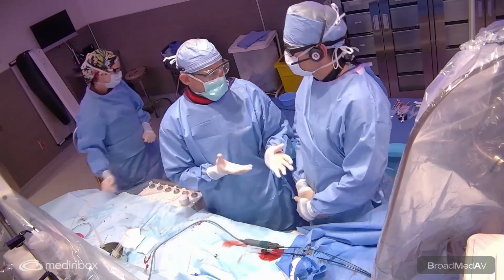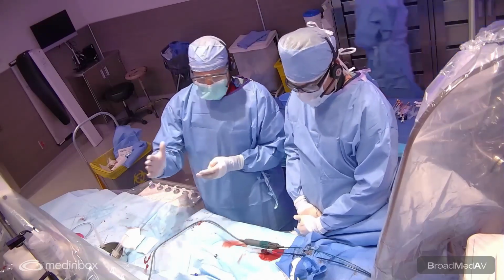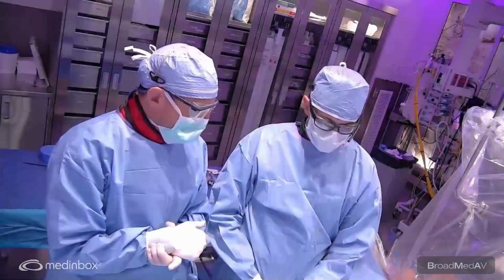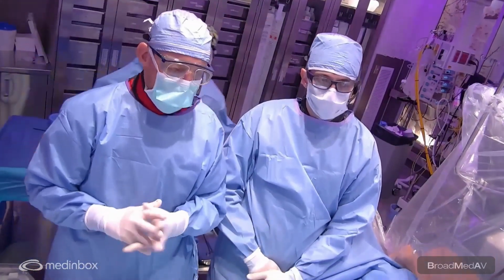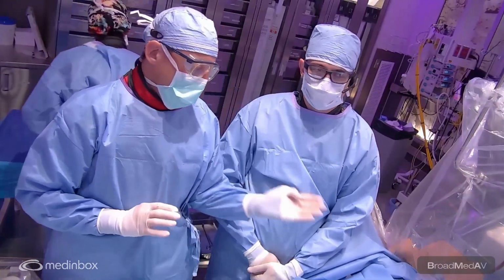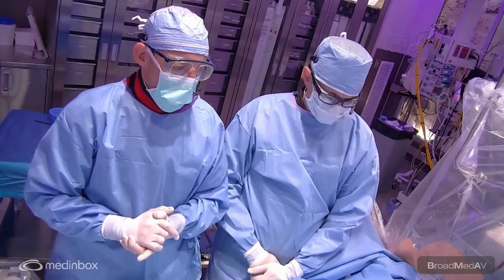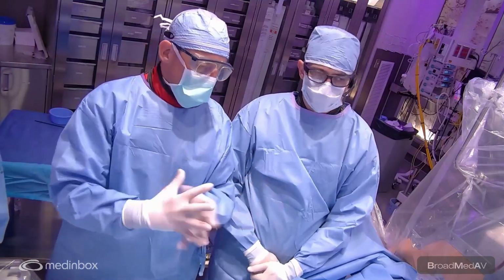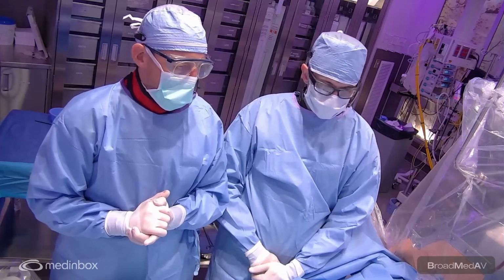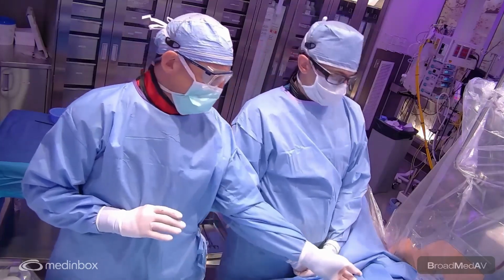And I think we got a decent image today. It was not perfect, probably because the aorta was dilated, and for sure because the septum was very aneurysmal. I think we demonstrate well that it's doable to close under ICE. The advantage is that you're preventing a general anesthesia and a transesophageal echo, and the patient will leave soon, tonight, by doing this under local anesthesia and ICE guidance. So not a perfect result, not a perfect image, but a very decent image, good enough to close the defect safely with confidence. Do you have other comments about the procedure?